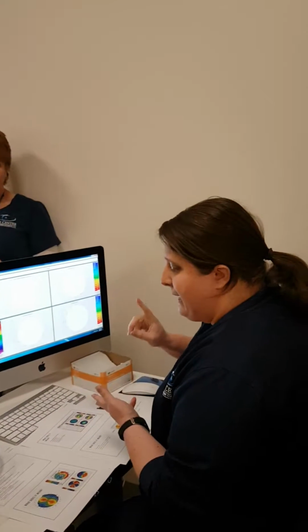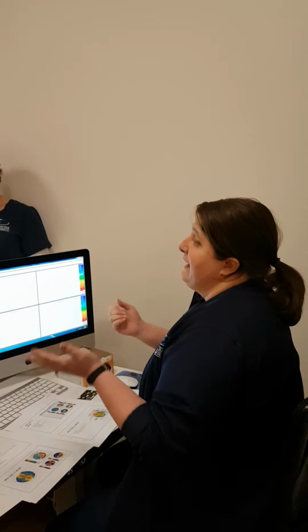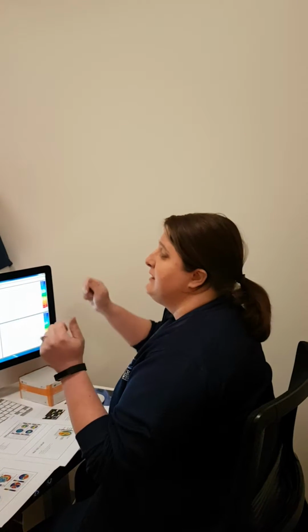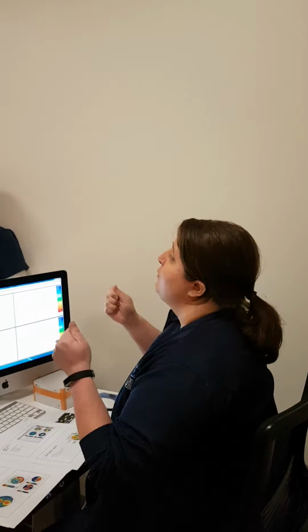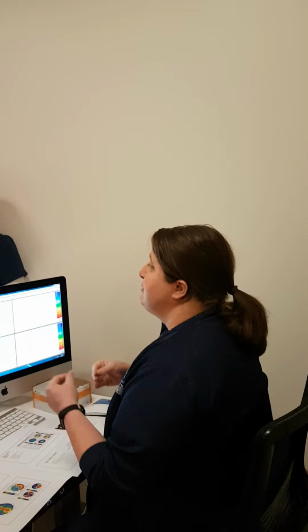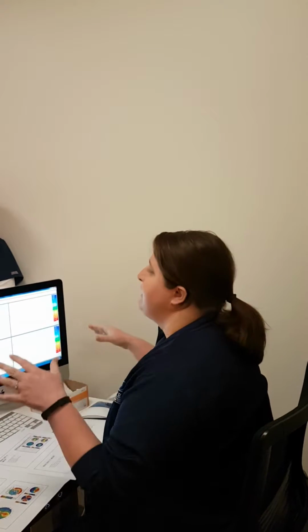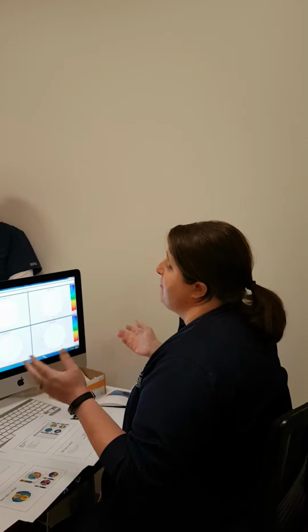So refractive surgery, pre-op cataract surgery, post-operative PKP and DSEK. PKP, again, you're dealing with an irregular cornea that has lots of sutures in it, and the doctor's aim is to try to remove sutures strategically so that when we're all done, we have as round of a cornea as possible. So the corneal sutures don't have to come out. Usually they do, a little bit at a time, but say they're magically right after surgery, cornea is totally round and it never has to be adjusted. Those sutures can stay in unless they break.